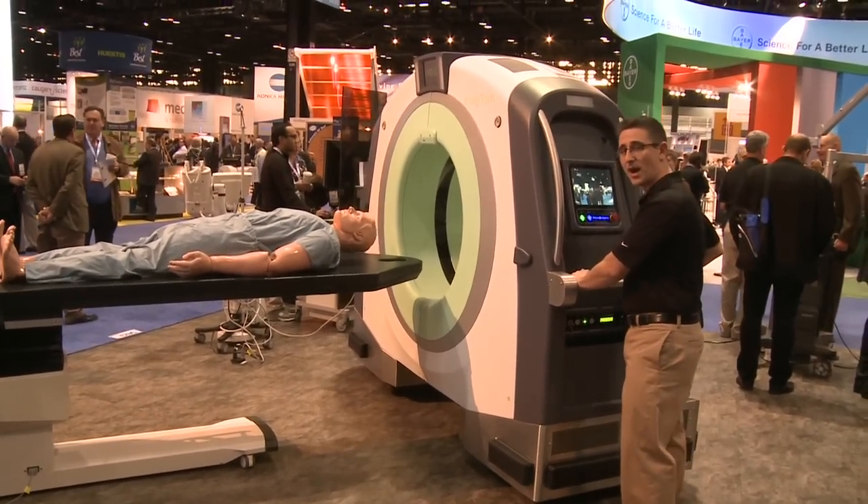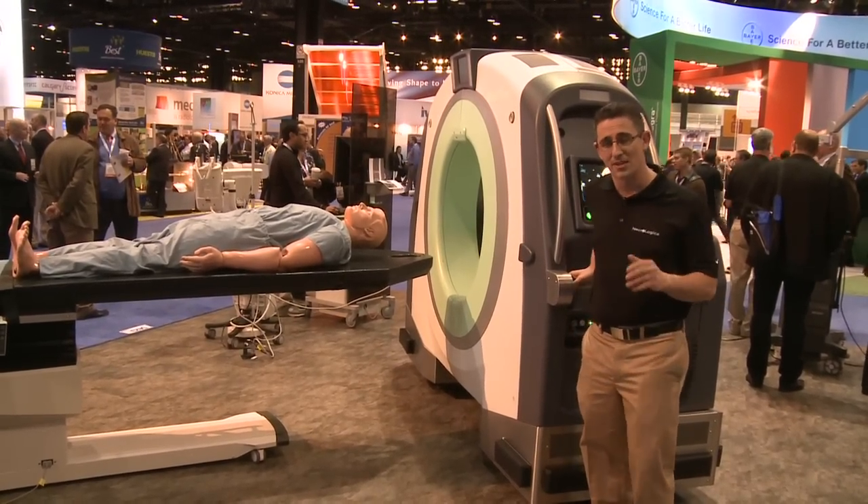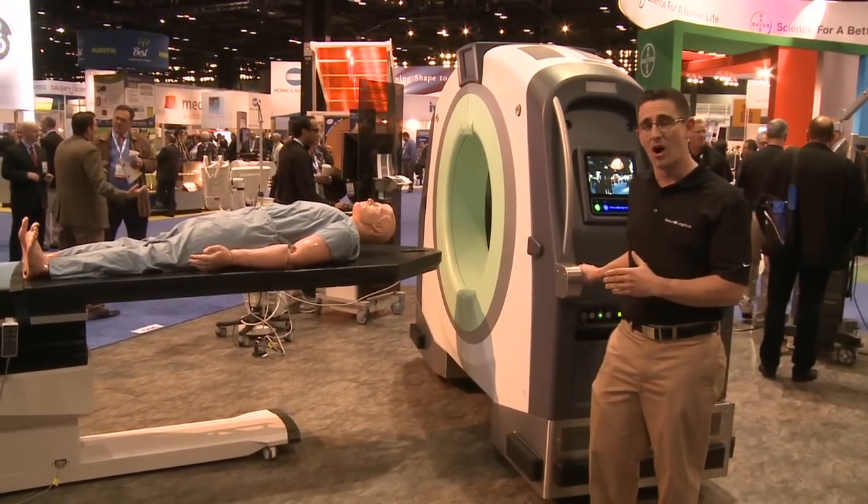From here, we can take BodyTom anywhere in your facility: through hallways, through doors, and even in patient elevators, into ORs and ICUs.